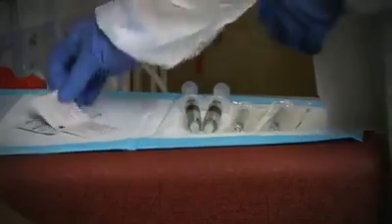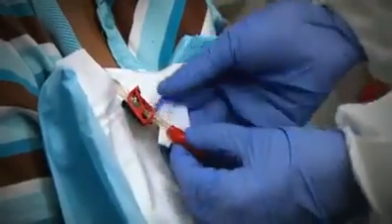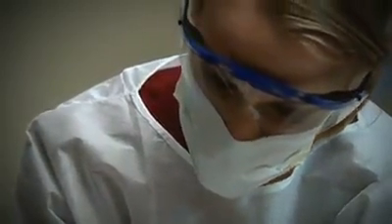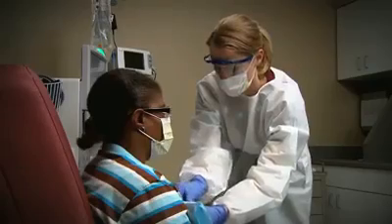There are two approaches recommended for proper scrubbing of the catheter connection area. In the first and more commonly used approach, you disinfect the cap and exposed areas of the catheter near the connection site by scrubbing it. Use an antiseptic agent like chlorhexidine, alcohol, or povidone iodine before removing the cap and connecting the dialysis blood lines to the luer lock connector. With this approach, the areas under the secure caps are assumed to be protected and sterile. If they're not, you might contaminate the inside of the catheter and could expose the patient's blood to harmful bacteria.